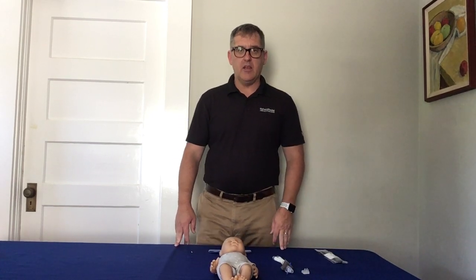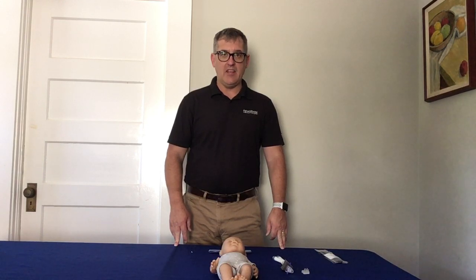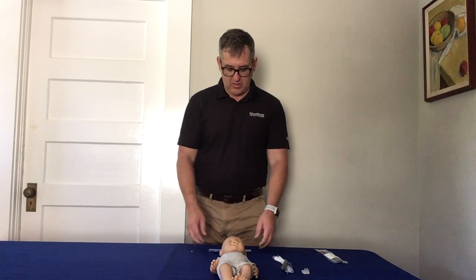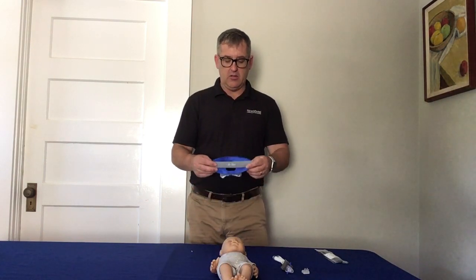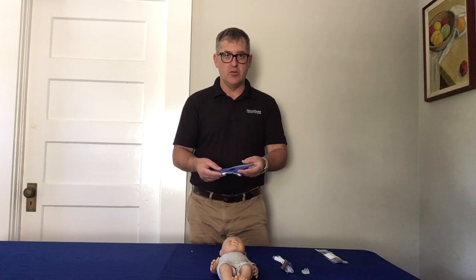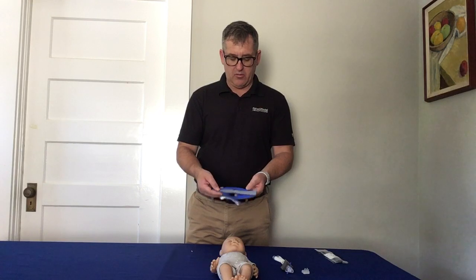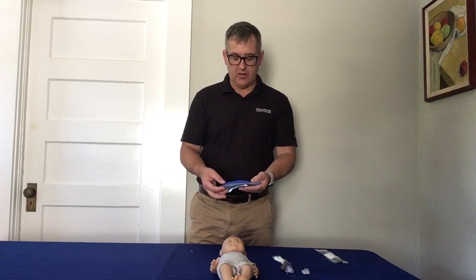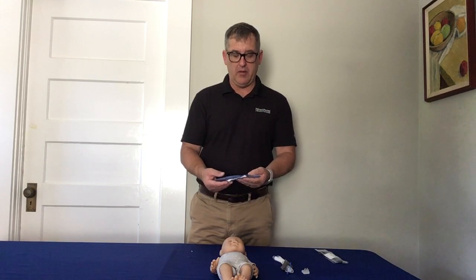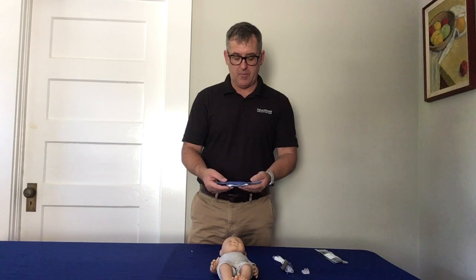Hello, Ryan Selby here again, and in this class we're going to talk about using the headgear for the Flexitrunk and the chin strap for the Flexitrunk. Now the headgear is typically used on babies that are pediatric size or in very large, close to term or about 36-week babies who might have particularly large cheeks. So you'll use a headgear because you need something that holds on a little bit firmer and doesn't slide off like potentially a bonnet would with a baby that's a little bit stronger.